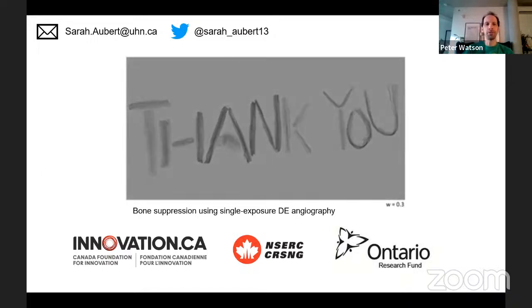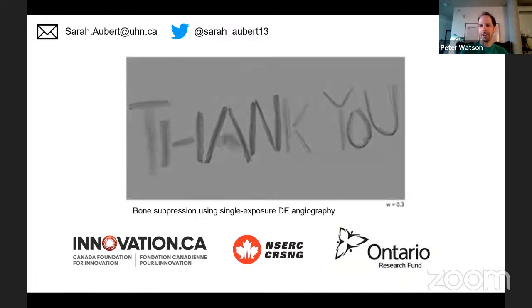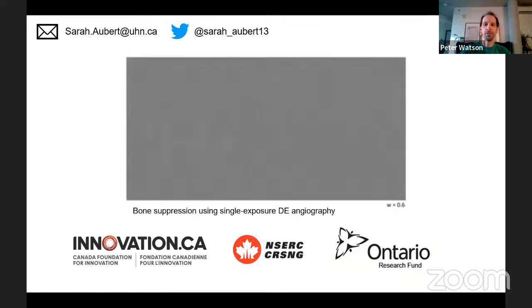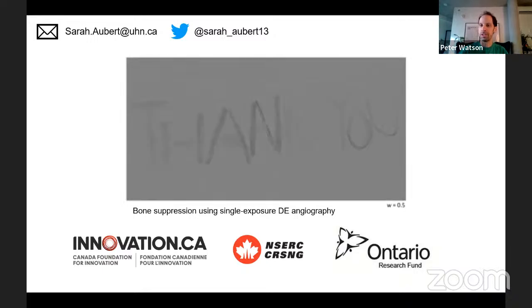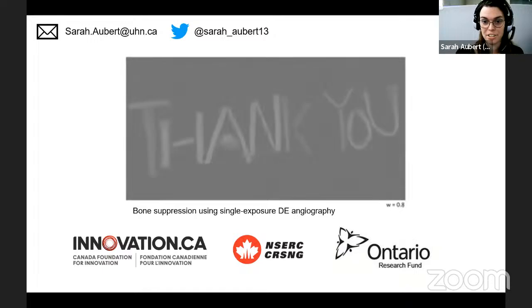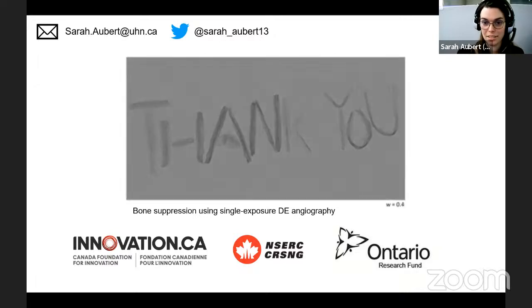The motivation for this was really saying that DSA is great, but it takes too long, so you can't image coronary or anything that's going to be moving like a heart. In terms of temporal speed, how fast is it to do the single exposure DE? Is it just as fast as the kV switching, so you can get many frames per second? Yeah, it's actually faster than the kV switching. There's a group right now out of Buffalo that is looking at the temporal speed of this. And I believe they're using something like 1,000 frames per second.